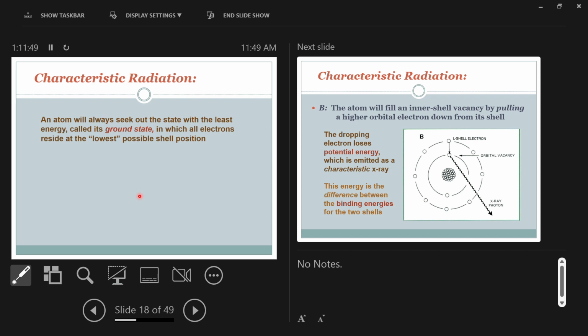So when you have a current, and the current is moving, the electrons are being pushed from the source, but they're also being pulled by the atoms needing to be filled. The atoms needing to be filled is another way to say the charge. That's why we call voltage the potential difference, right? It's an energy pulling you this way, right?